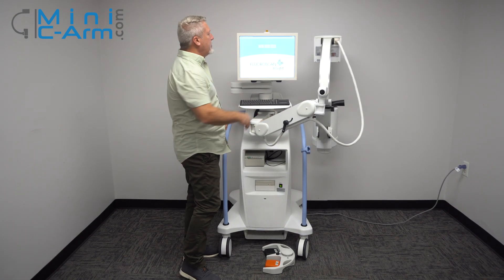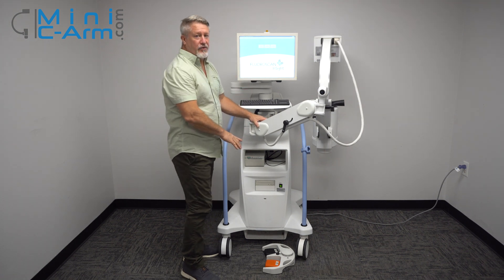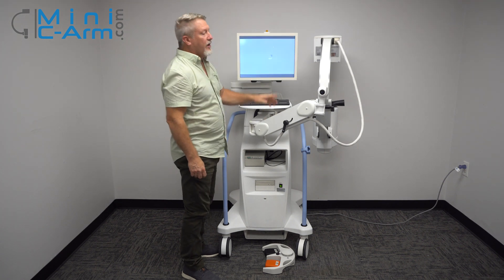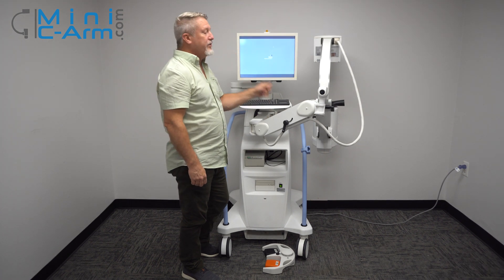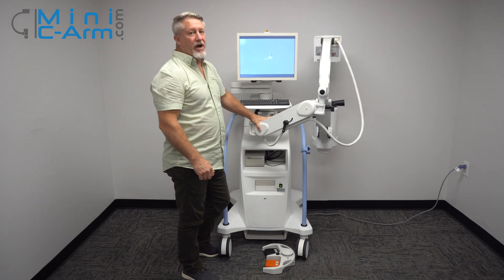If you're finished using the machine, just hit the shutdown button on the screen. Please do not use the on/off button to shut down. Pressing the shutdown button allows Windows to shut down properly. After it's shut down, please unplug it from the wall, because there are components running at all times when it's plugged in.